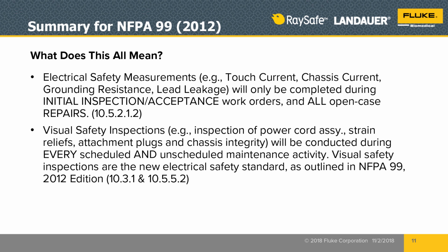So trying to summarize, what does this all mean? Why does it really matter? There's still a mandate to test electrical safety at initial inspection or acceptance when you're bringing your medical equipment in, and during all open case repairs. So there isn't that mandate to do electrical safety annually, but anytime you do a repair or are working on the medical equipment, you do need to be making sure that the electrical safety testing is performed to make sure that it's still safe and that everything's connected correctly after everything's done.